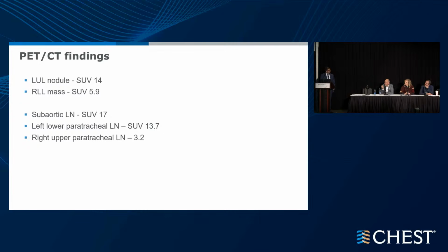I'm not saying it's not common. We are aware of the literature. It's probably not as common as reported in those studies because we learned to keep the lung a little more open. The concern I would have with going to the nodule first, on the right side, is that it's pretty close to the pleura. If I drop the lung and something happens, then I miss the opportunity to do so many other things in this case. There are so many lymph nodes. There is a left-sided lesion. So then what, repeat the intervention? So I don't think there is a right way. I think we can hear both concerns. I'm just offering an alternative.